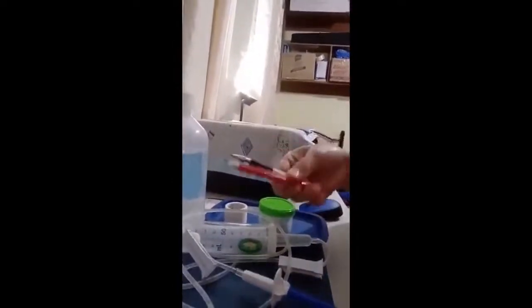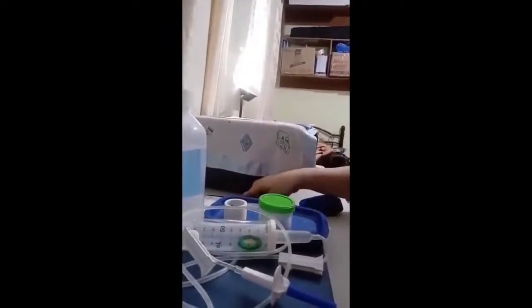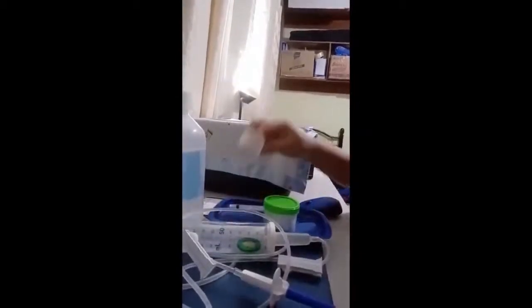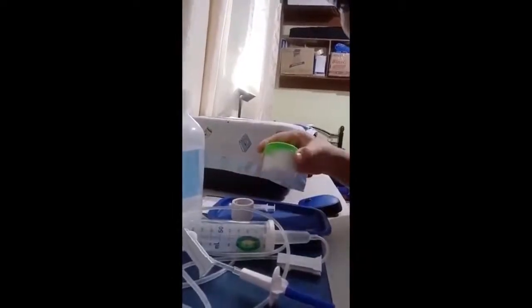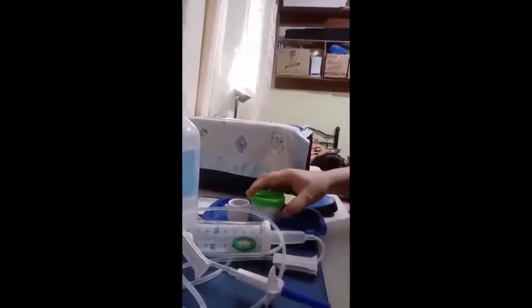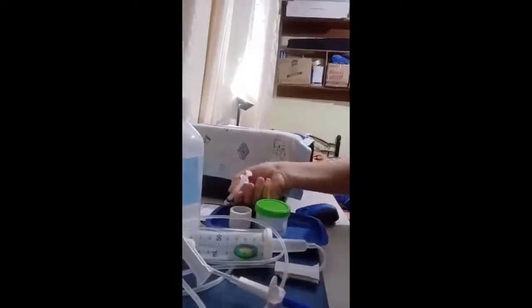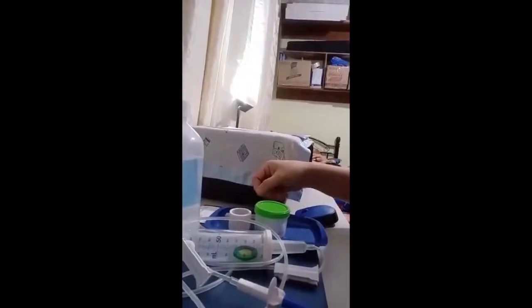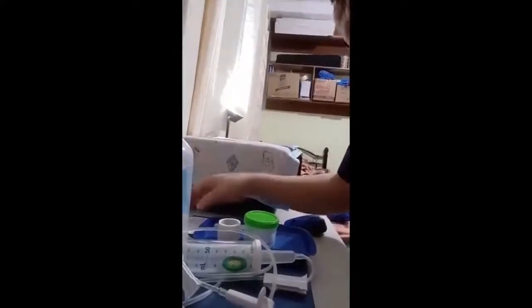So we must have the red and black ball pen, the medication tray with the micropore tape, and cotton balls with alcohol, the IV solution and IV set, and the 3 cc syringe, and we should be sure that everything is ready before approaching the patient.